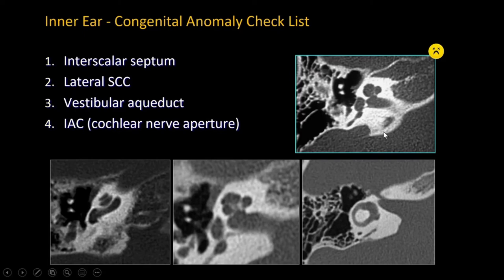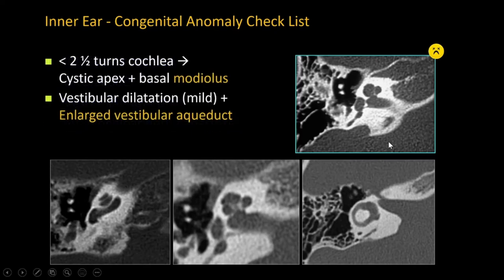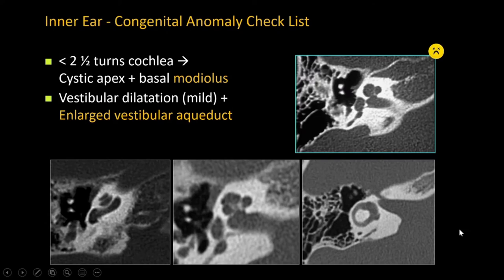Here is an example where some structures are not quite intact. The apical turn is not well formed — it is a little dilated and cystic. The modiolus is not well visualized, and there is missing interscalar septum with barely visible basal modiolus deficiency. Notice there is a large dilatation of the vestibular aqueduct, roughly parallel to the posterior semicircular canal — very abnormally enlarged. This is a classic example of incomplete partition type 2, classically known as Mondini malformation, although we try to discourage using that term.